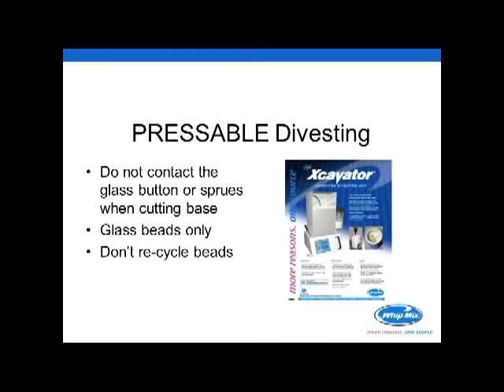And then you don't want to recycle glass beads. Once you've used them, they're no longer a bead. Now they are a flying shard of glass. And also, they're not very clean anymore. We still have the chemistry that's left over from the investment mixed in with them, as well as silica sand that came from the investments. Now you're not really shooting glass beads. You're shooting all kinds of things on your castings and pressings. So please don't recycle those, just like you wouldn't recycle aluminum oxide.